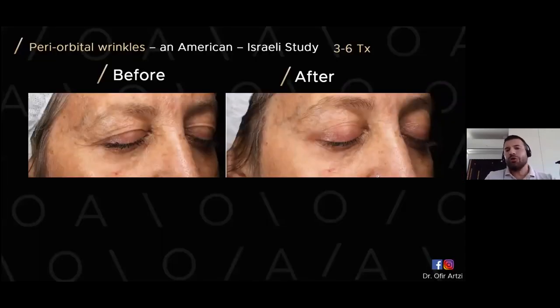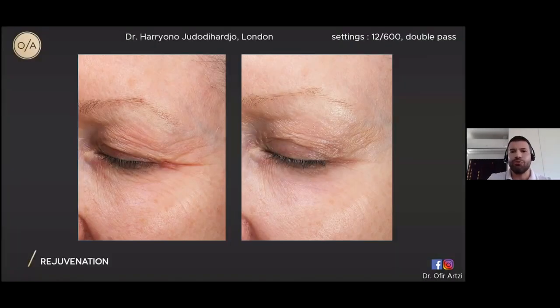So talking about the periorbital wrinkle, and again, this was part of the evaluation, but I do have to mention we finished, I think it was a 2-year, maybe even more, American-Israeli study, and we showed that by performing a few treatments, it's not one treatment, it's usually between 3 to 6 treatments, you can see the before and the after. We have an improvement of the periorbital area, mainly the wrinkly appearance, and this is very important. So we use it with the high setting for rejuvenation. I usually do not use it with the very high setting. This is a picture from London by Dr. Ariono. You can see the setting, and I'm sure you can appreciate the result. In a minute, you will see the downtime.